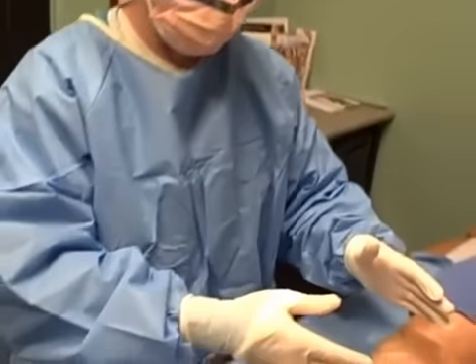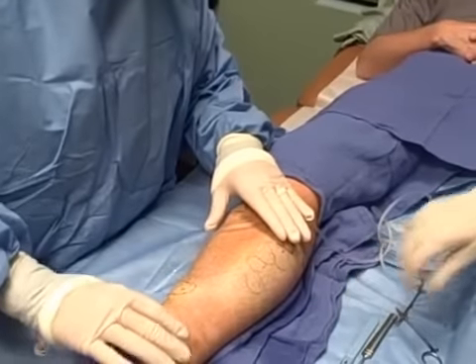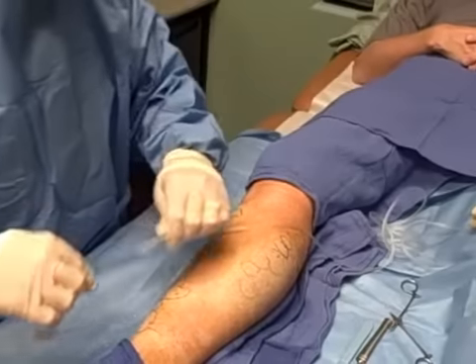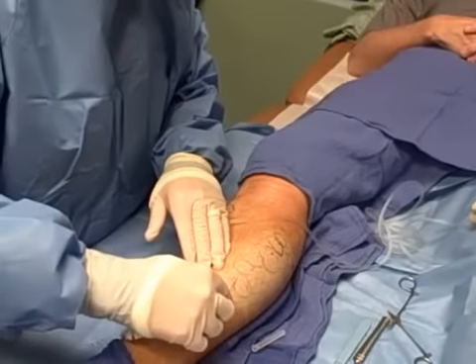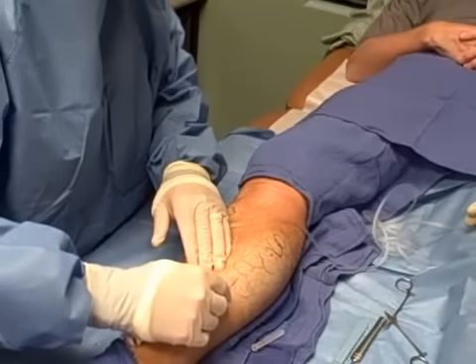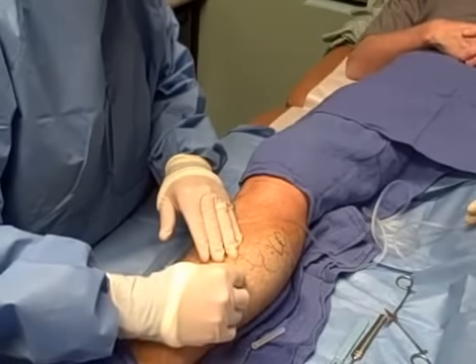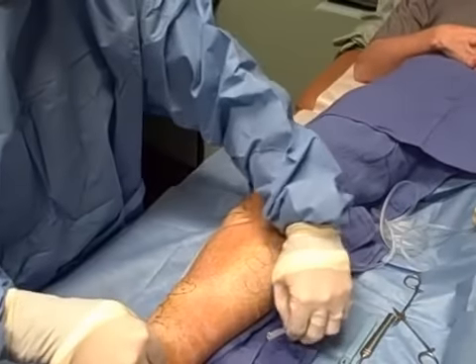I'm going to have the camera pan down to the leg. This is the right calf and shin, and what I've done is drawn circles around where the varicosities are located. I take a needle — this is a solution that has lidocaine and epinephrine in it with saline — and I go under the skin. I've already done a little bit of this so it's not hurting the patient. The lidocaine and epinephrine helps vasoconstrict, so it really decreases the amount of blood loss, which is obviously nice for lots of reasons.